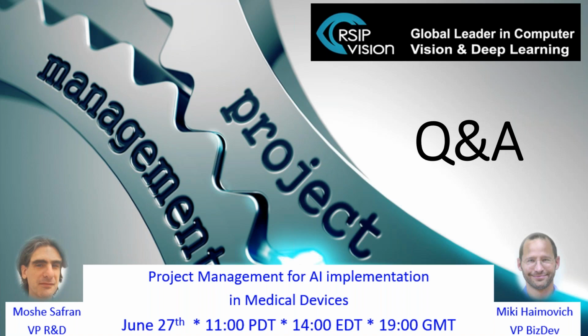And the last thing is that oftentimes, even if just for FDA reasons and regulation reasons, our goal is not to produce something that is 100% accurate. It's not that we wouldn't love that to happen, but there is a lot of value in such a solution, even if it's not 100% accurate, because the user is using the AI solution. We do not replace the humans, but rather we help them. So if an AI solution can reduce the number of mistakes, or save time for the user, then that's a significant value, even if it is not 100% accurate in all cases.